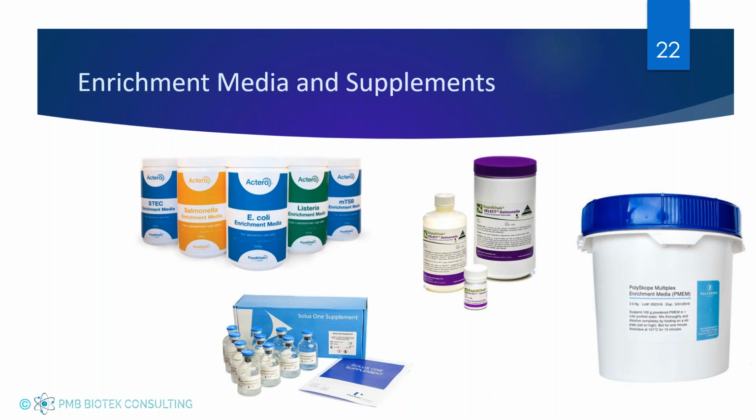You'll also see specific supplements that are designed to target non-target organisms. So if you're looking for salmonella, we can put phage or some other sort of supplement into the product that will reduce Klebsiella or Pseudomonas, which are going to be found on your flour product. And if they're not there, it will help us grow the salmonella to higher levels.